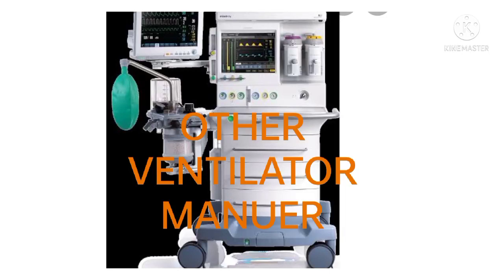Other ventilatory maneuvers: positive end expiratory pressure, PEEP. It is a ventilatory maneuver in which positive pressure is applied to the airway during exhalation. Normally during exhalation, airway pressure drops to near zero, and exhalation occurs passively. With PEEP, exhalation remains passive, but pressure falls to a preset level, often 3 to 20 cm H2O.